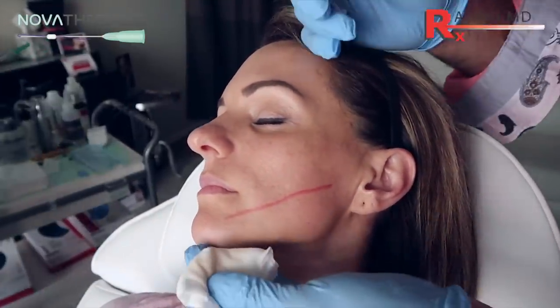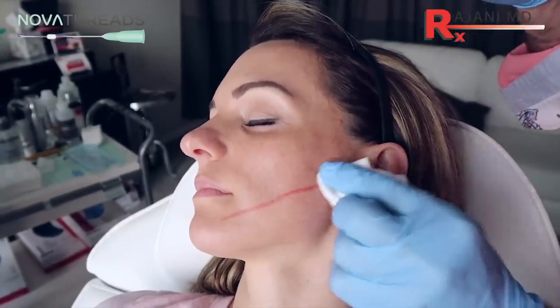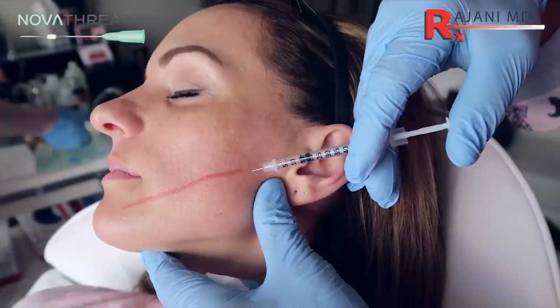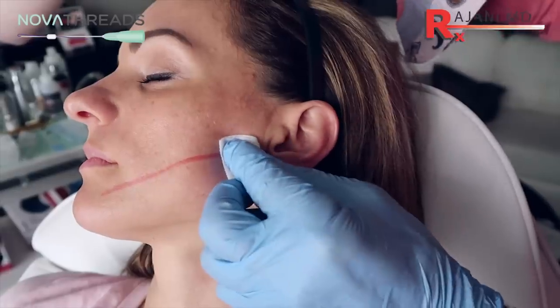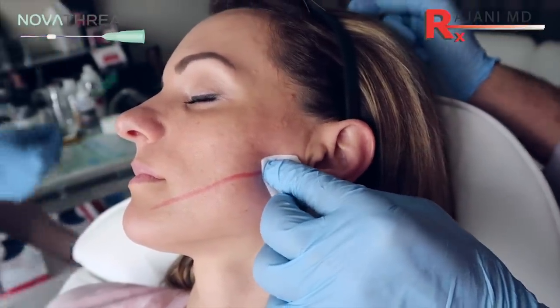This patient looks great — there's very minimal downturn, but it's going to be preventive and give her a nice look of turning up. Everyone wants this area treated. This is a little lido with epi, and I'm going to put it right back where our opening is going to be with an 18 gauge. This is a 31 gauge — a little poke here — and then I hold a little bit of pressure.